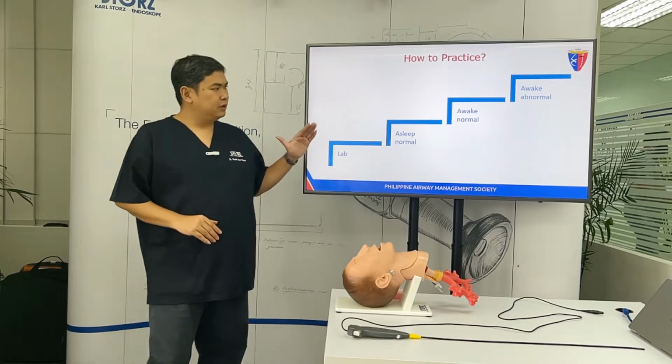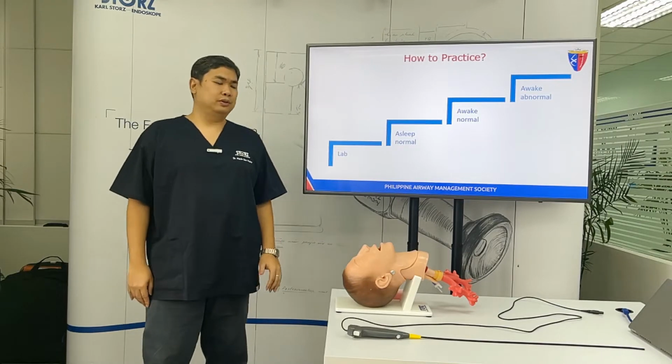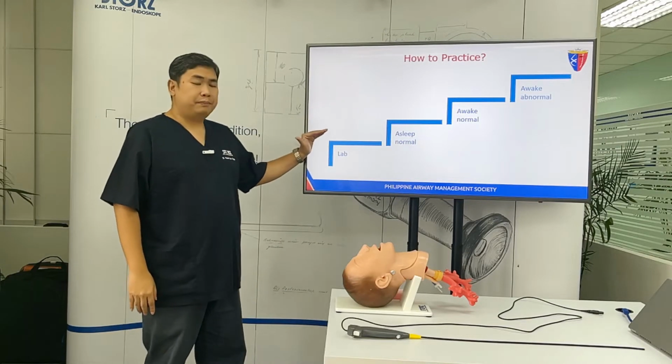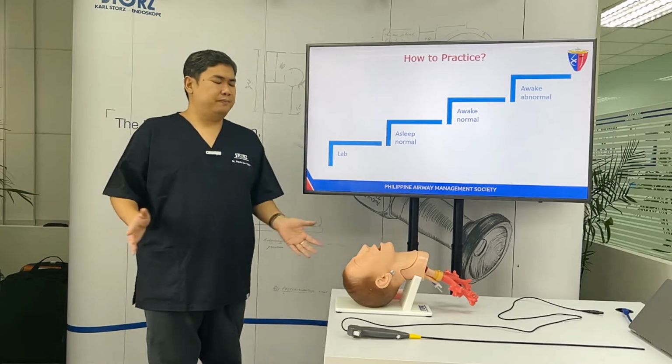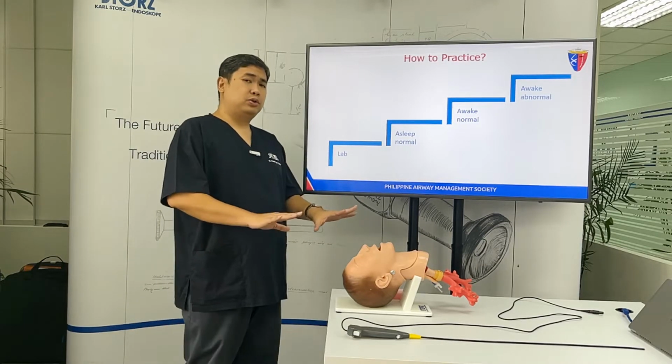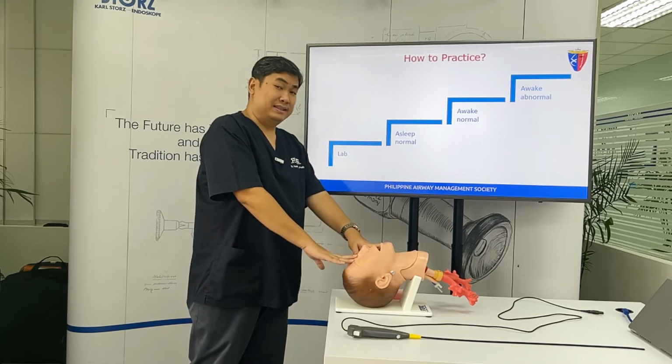There's a stepladder approach on practicing flexible endoscopic intubation. The first step is the lab. So we could practice on animal lab or dry lab. Most commonly, we practice on mannequins.